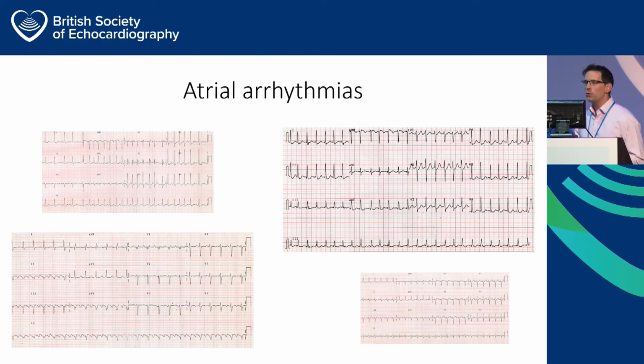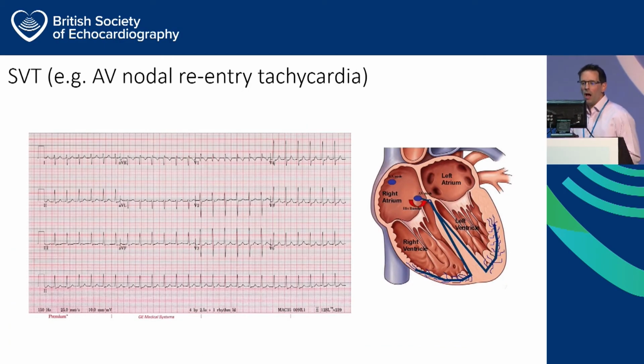So, we've talked a bit about ectopic heartbeat sensation. I'm now going to move on to talk a bit about atrial arrhythmias. I don't understand these ECGs. I just put them there to try and look clever. I'm not an EP doctor, so I'm not going to go through the actual ECGs in that much detail. I'm just going to relate it back to that question I gave you a minute ago, which is, it's not about the palpitations, it's about, do I think that represents underlying structural heart disease? Because that is where the echo is adding value.